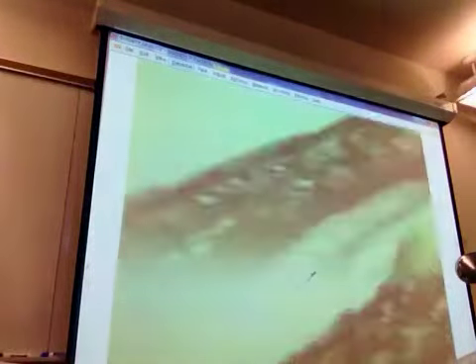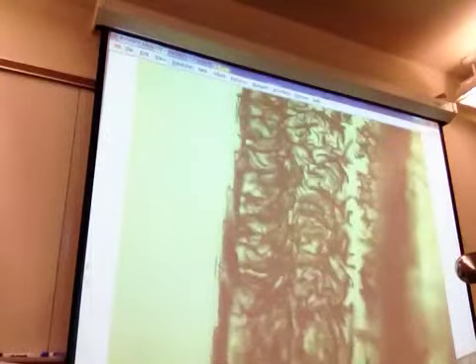Just FYI, in the PowerPoint, it doesn't say what kind of epithelium it is. Well, I talked about it. I know I did, because I remember looking it up before that class. Dude, I'm so glad that I'm not showing you guys the slide of the test tomorrow. This is fallopian tube. That's interesting, a different stain. It looks like a sweater.